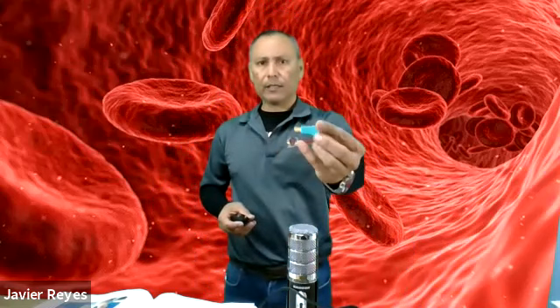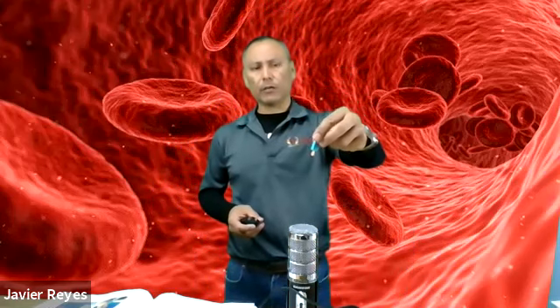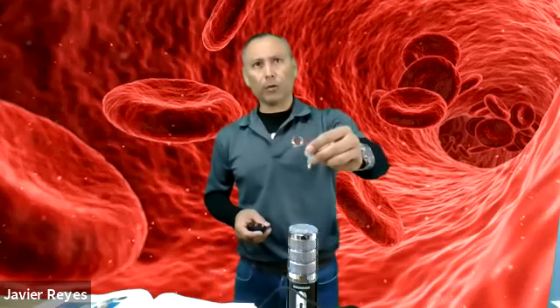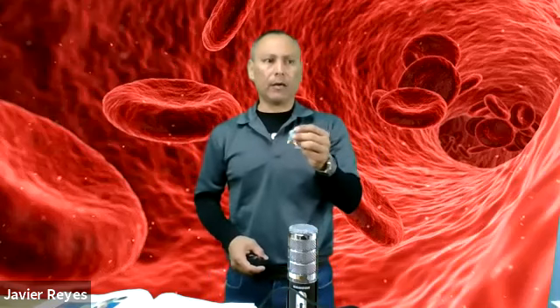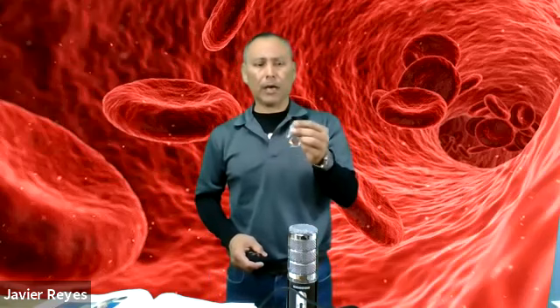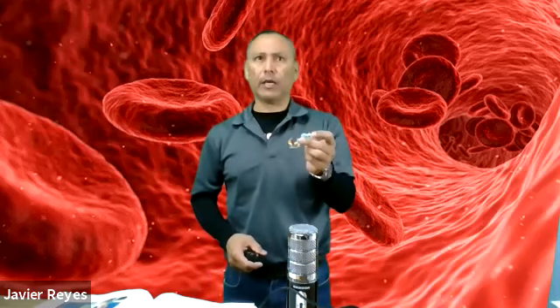This is a lancet device, okay? And it is very commonly used in this manner. Of course, there are various presentations, colors, and so on, but they have to be sterile. They cannot be used more than once. They are meant to be disposable. They have a sharp point inside them, okay, and it is retractable. That is one of the OSHA requirements that defines a lancet device. It has to have a permanently retractable needle or blade. That means once you activate it, it cannot be activated once again. All right.